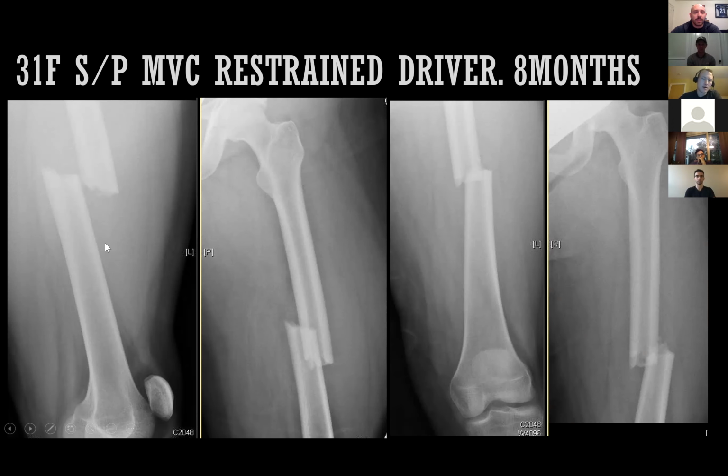So here, if I were to describe this fracture. Before you do, let's have Tej give a shot. Oh, Tej is going to give it a shot. Can you unmute yourself? Tej? So you have an AP and lateral of the left femur. You can exclude that. You don't have to say AP and lateral. That's okay. We'll just assume that you know that it's an AP and lateral.